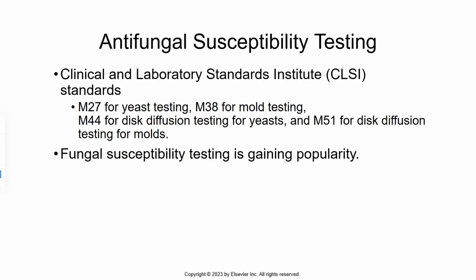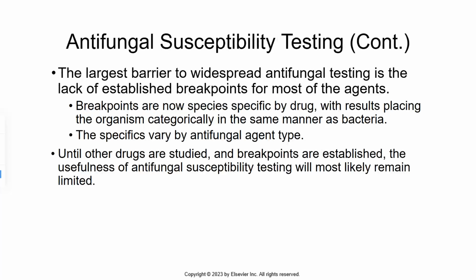The Clinical and Laboratory Standards Institute has standards for antifungal susceptibility testing. There are special media plates that have to be used. And fungal susceptibility testing is gaining popularity, primarily because C. auris is so multi-drug resistant that now we're starting to consider more types of this testing.